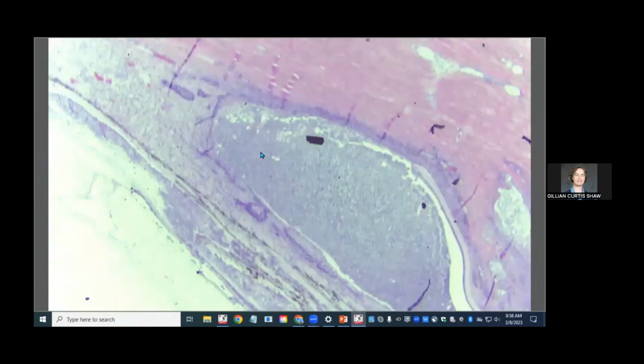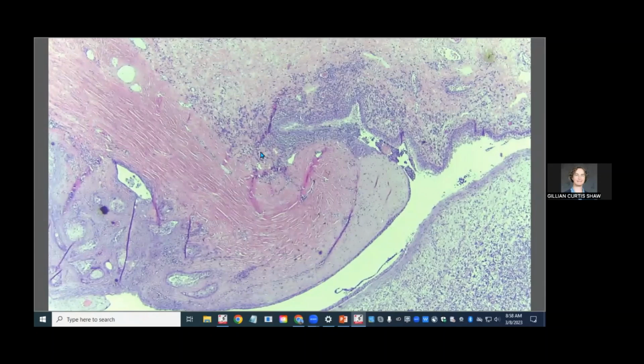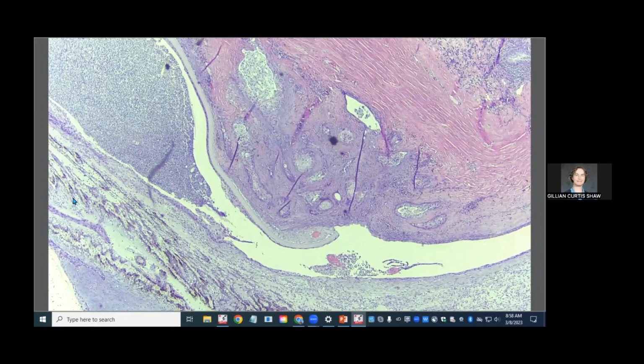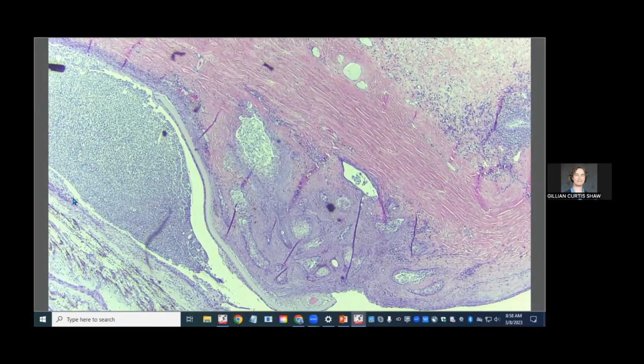So here we are. This is that limbal area. This is the remnants of corneal stroma, maybe. Here's the iris that we were seeing before. And then we have all of this increased cellularity in these tiny little islands of cells. And these islands of cells don't belong here. This is not their home.